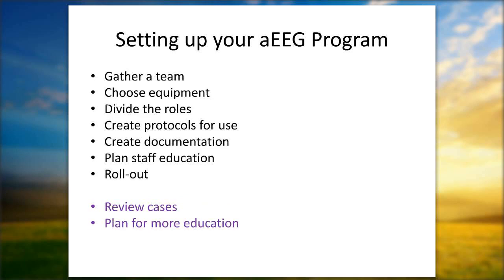So then finally, the thing that I think is important is to realize that this is not a one-time education, one-time implementation. This is a long-term process, and setting up your aEEG program will take time. It will take dedication and commitment over probably a year or more.